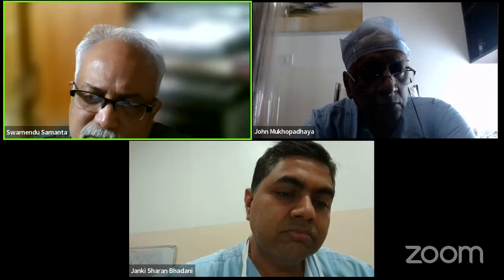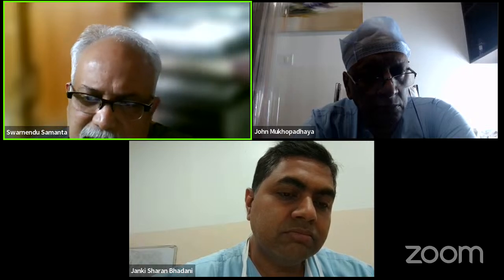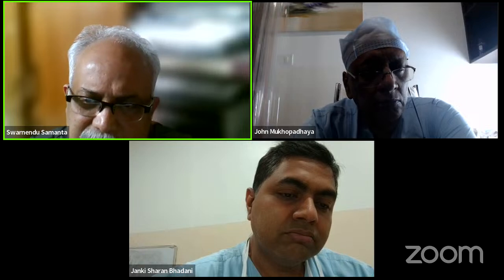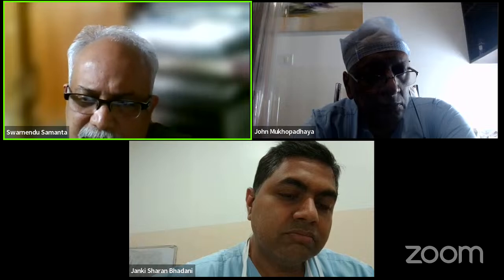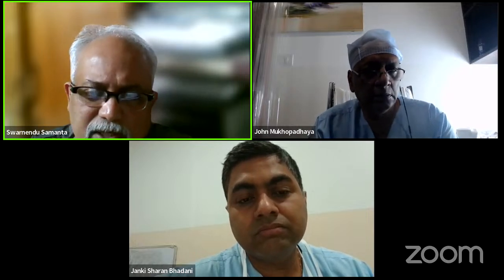So for diagnosing the frozen shoulder, you have to rule out all the medical issues, see the external rotation and the global restriction of movement, even the night pain is there, and then you have to investigate properly with the X-ray. And I always do the USG, because the basic advantage of the USG is that it is dynamic, and second, we can test both the shoulders.